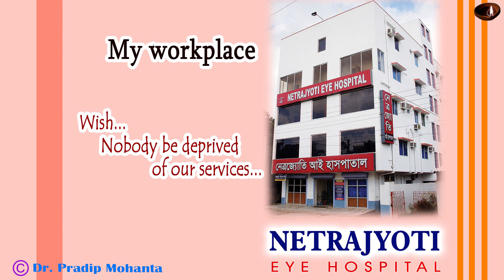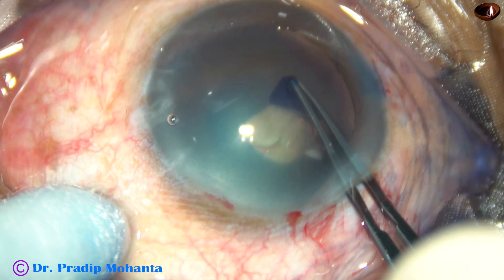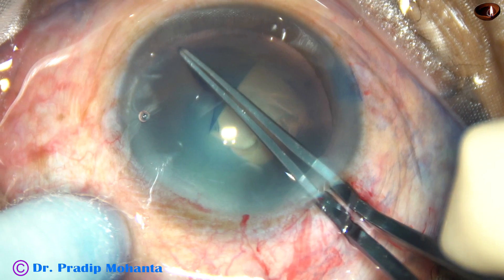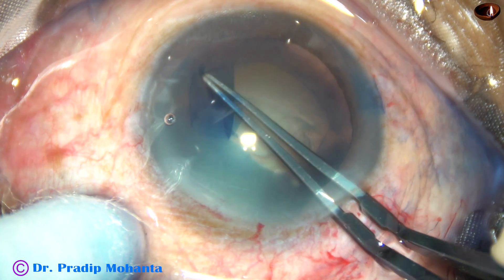Dear colleagues, welcome to my workplace at Rana Ghat, West Bengal, India. In this video, I am going to demonstrate the divide and conquer technique of phacoemulsification. This video is being dedicated to the ophthalmology residents all over the world.